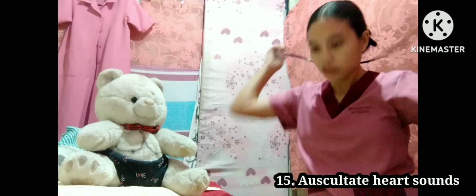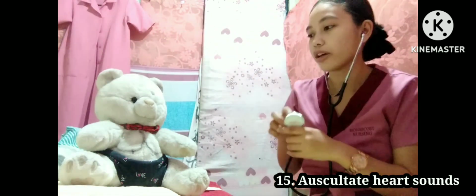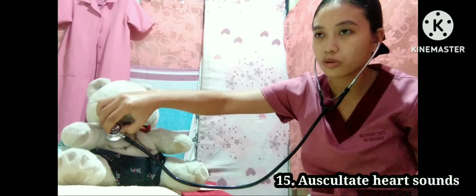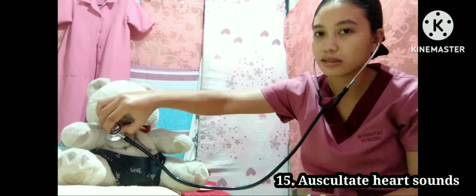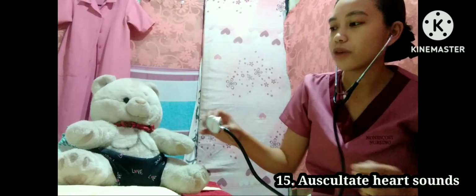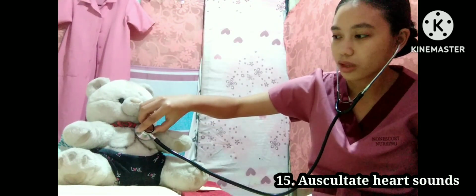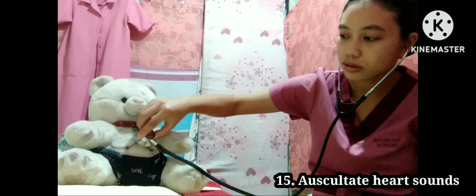So I'm going to start by listening using the diaphragm of my stethoscope. So we start in the aortic area, just right here. I'm going to be listening for the S1 and S2, the lub dub. And I'm listening for any clicks or extra sounds or murmurs. So right across from it, in the second intercostal space left of the sternum, is the pulmonic area. And then we move down.